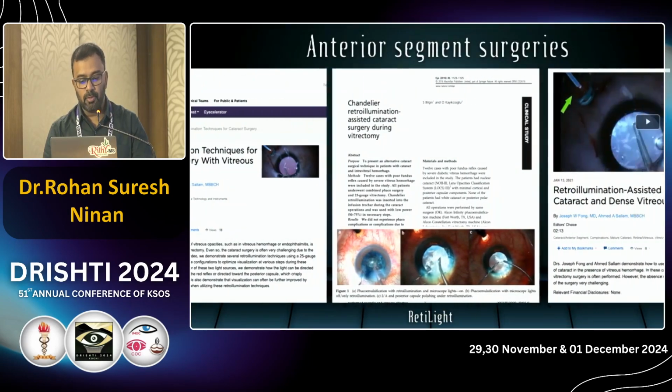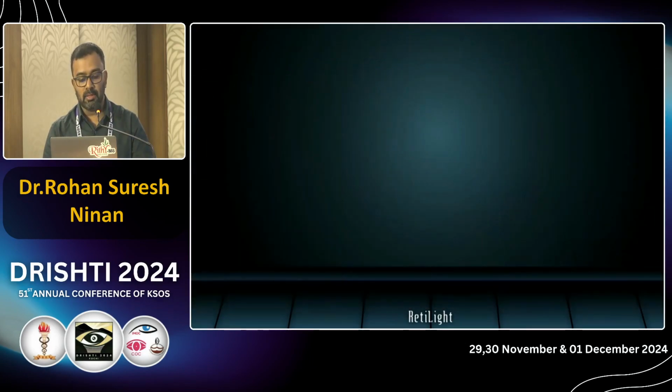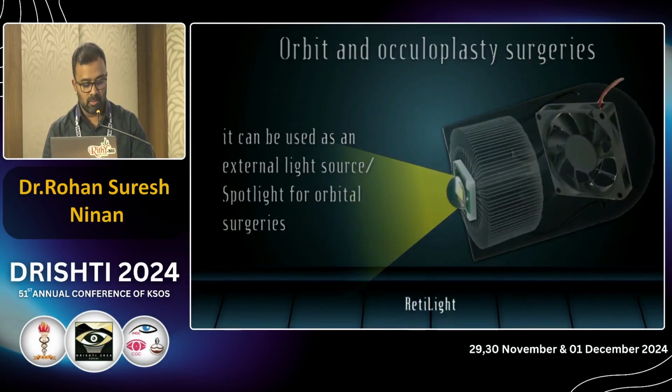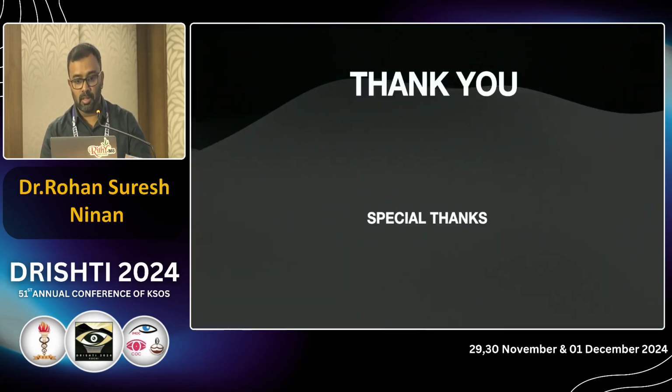It's also useful as a source of retro-illumination in anterior segment surgeries, and even as a spotlight during orbital surgeries. So it's frugal, universally modifiable, and ultra portable. It can be used not only by retina surgeons but also by other specialties, and it's a multi-purpose illumination device. Thank you.